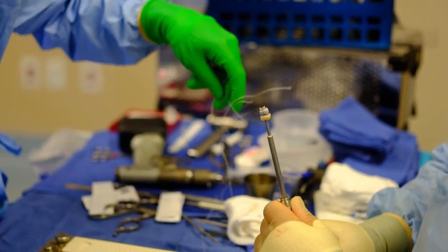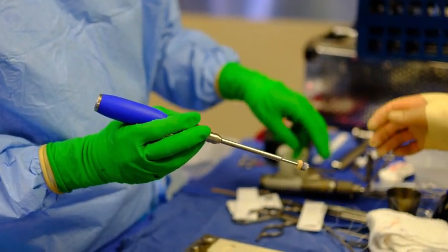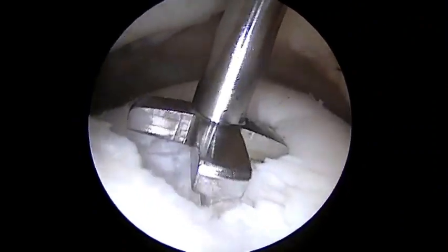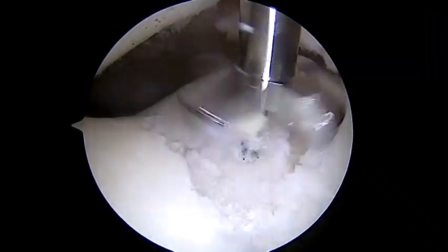The sutures are trimmed appropriately, and then we have a cannulated driver for this implant graft construct. The countersink reamer is used. The flutes are used to ensure that you are 90 degrees from multiple viewing angles.